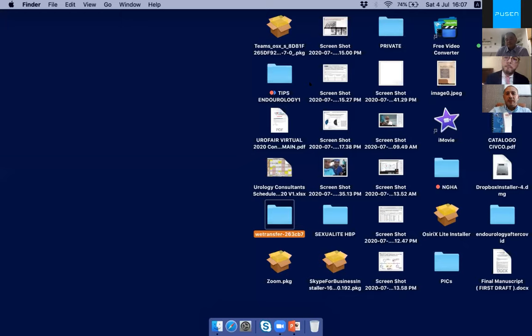Yes, I think in the beginning, we must select the patient, the case, well. A case of not very hard stone, not very big stone. I think 1.5 centimeters is good to begin. We must avoid the lower calyx stones.